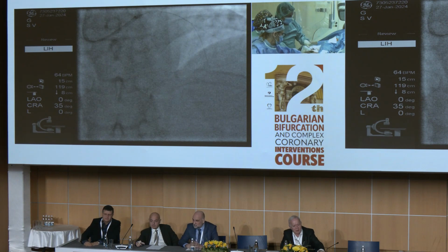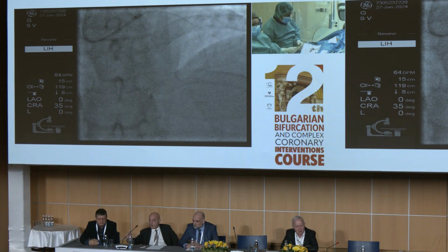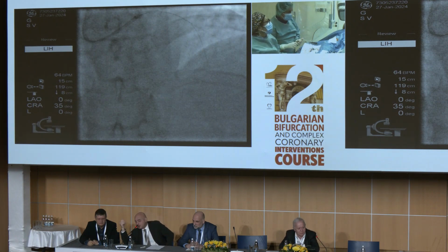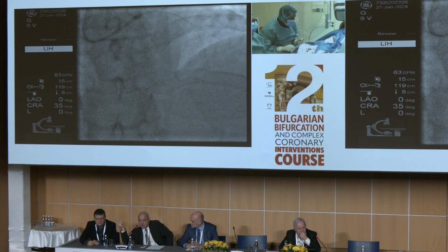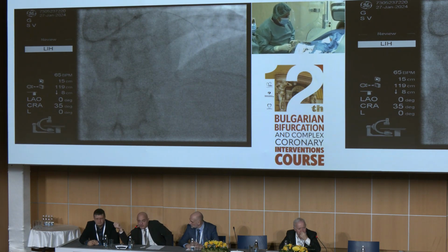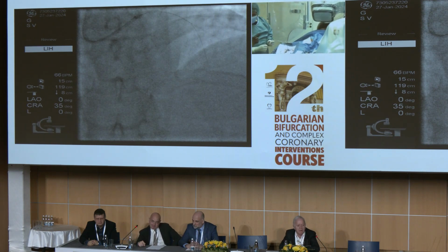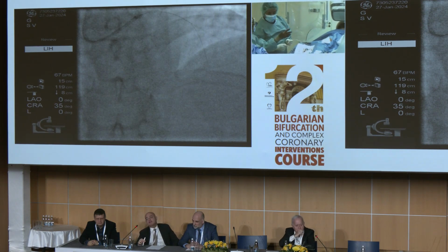But you are totally right. Probably I did not convince you. No, you completely convinced me. You started with the idea to make angioplasty, and obviously you planned the procedure with IVUS to make it IVUS-guided angioplasty. Thank you. We can show a picture after the nitro.